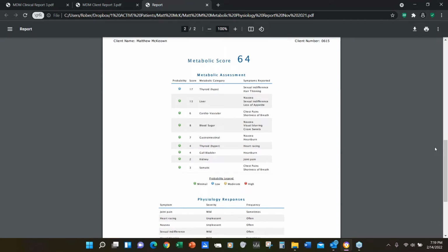I said that what this is looking for is the different body systems that this complaint or feeling state that you have might relate to. And it gives it a score, and then it lists things with the score. So I'm interested in many things here, I tell them. I'm interested in what your total score is. And this score of 64 is kind of okay.